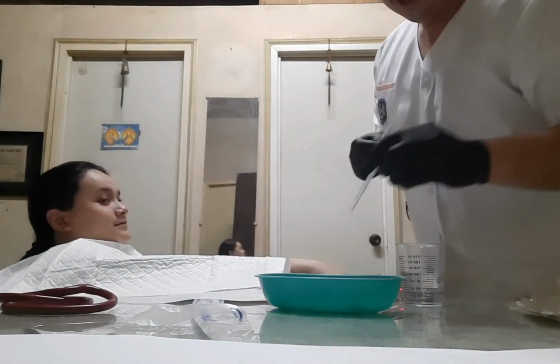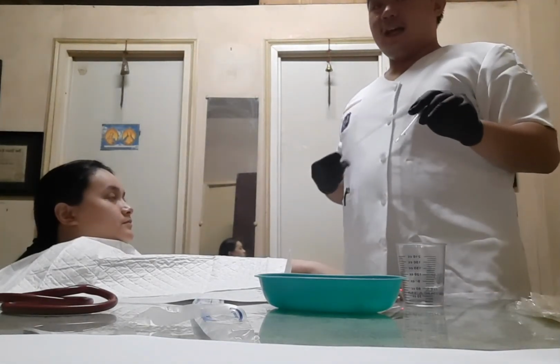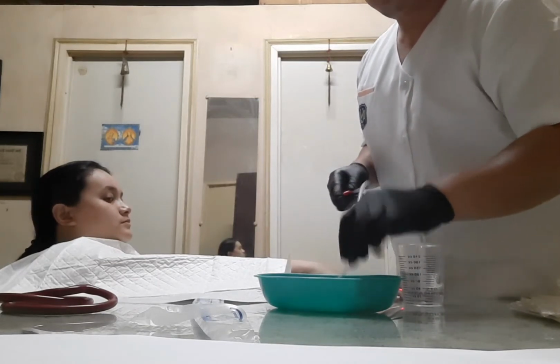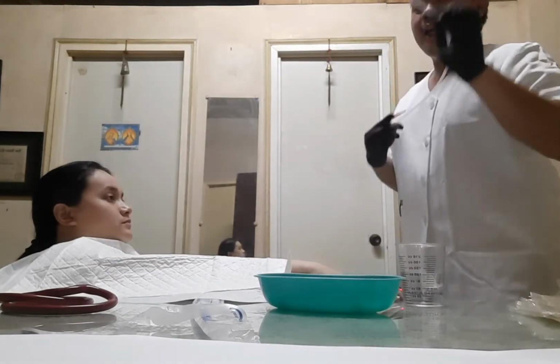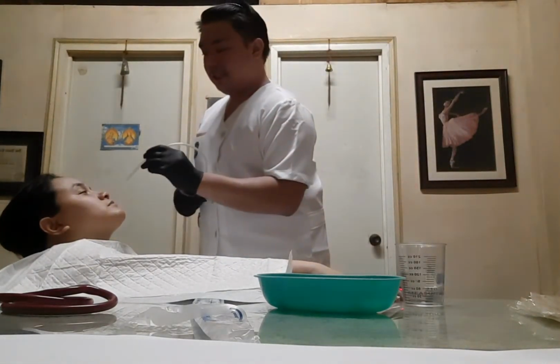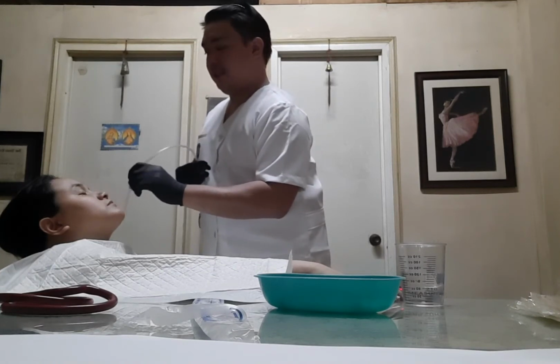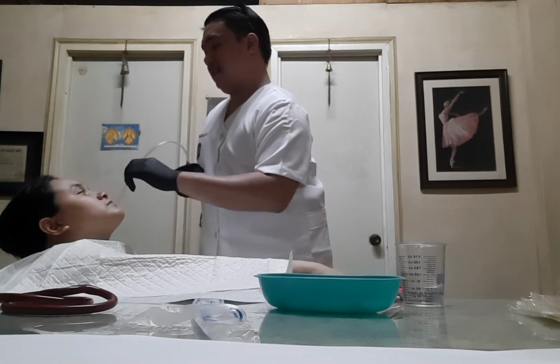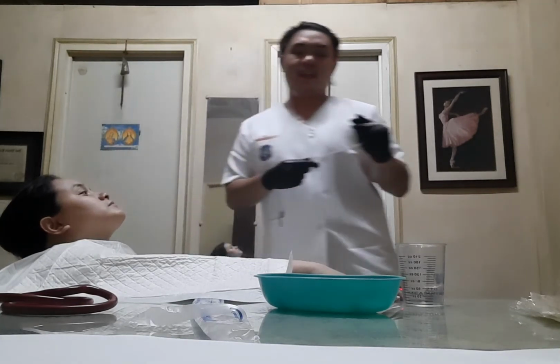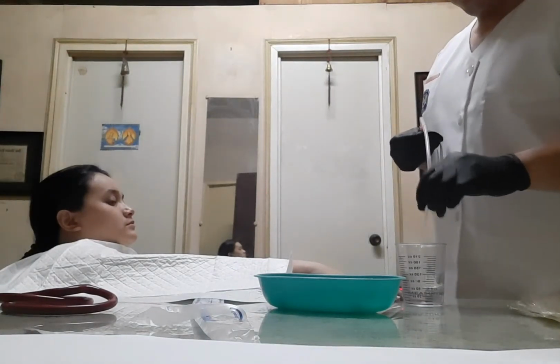So again, after you clean it with nasal NSS, apply again the water-soluble lubricant, and then again 10 seconds of suction at 80 to 120 on the wall unit. Insert, rotate, 10 seconds, and in, out. Now just put it in the saline solution.